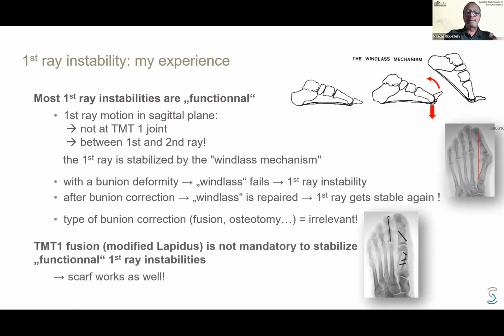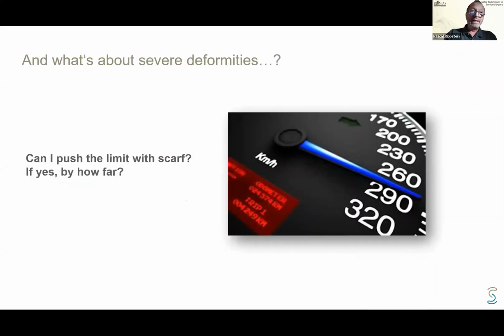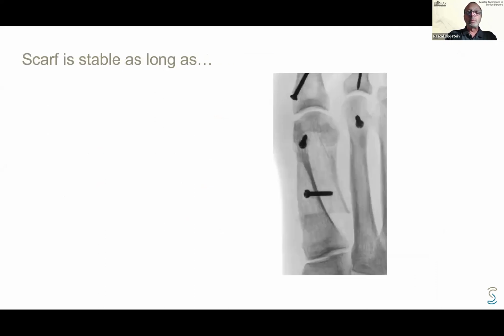What is important is that we restore this windlass mechanism. So I realized over the years that the TMT1 fusion, the modified Lapidus, was absolutely not mandatory to stabilize a so-called, what I call a functional first ray instability, and the scarf I love to perform will work as well. Now, I still had to deal with the severe deformities. I would have loved to correct them also with scarf, but I had to find out how far I could push the limit for the indication of scarf, and this is what I learned over the years.